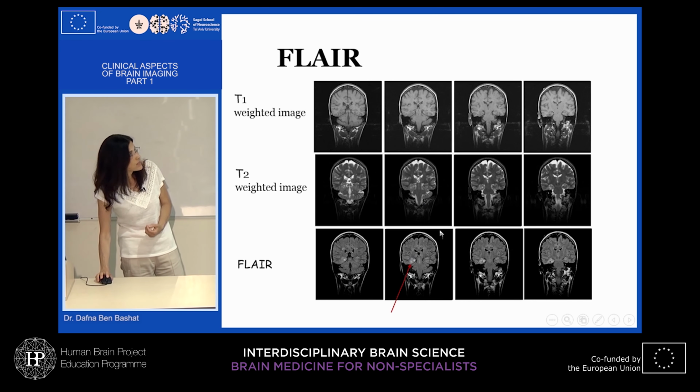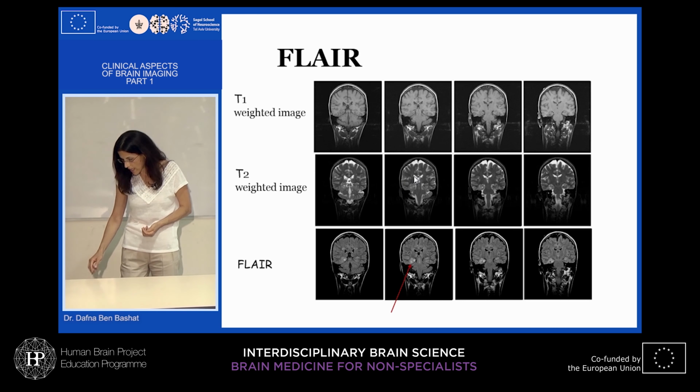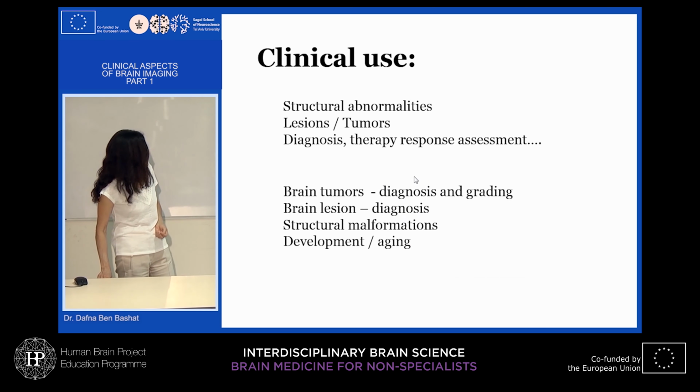Theoretically, these two images are exactly the same. But radiologists can see this pathology, while you cannot. So all the development is really about new contrast, to assist radiologists in diagnosis.